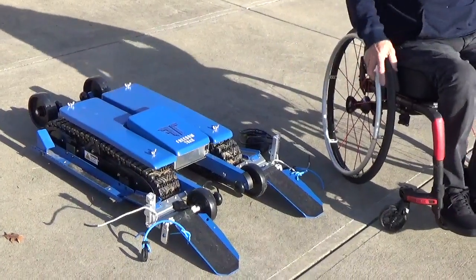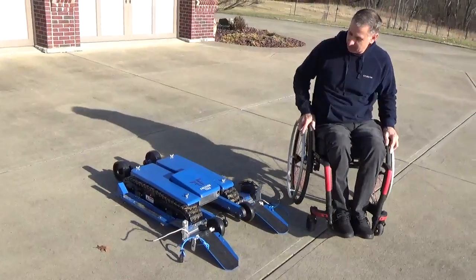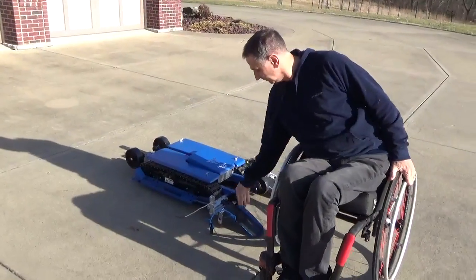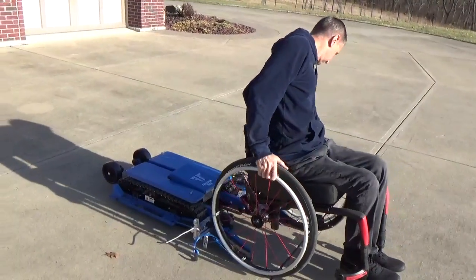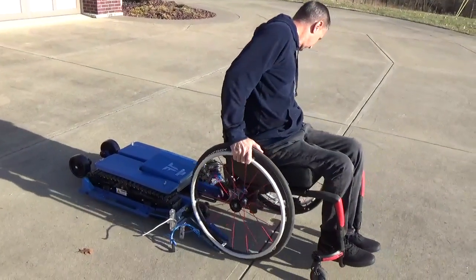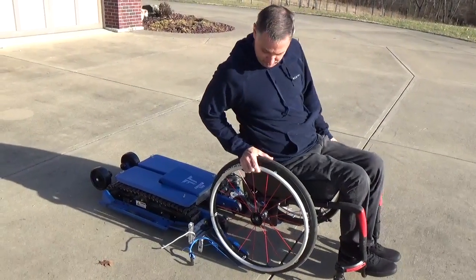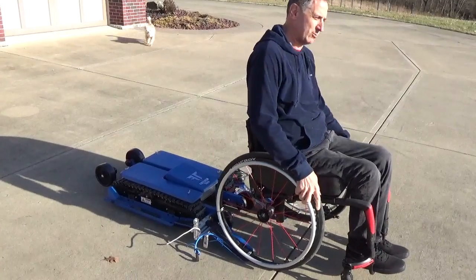I'm just going to back onto it. Now it's a little tricky backing onto — it takes a little bit of getting used to, so I may not get it done the first time. I'll just come up to it here and try to get lined up straight. And then once you're straight, just kind of go for it — lean back and give yourself a push backwards. So here we go.